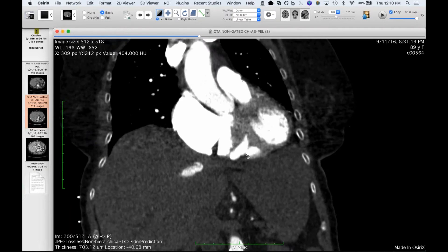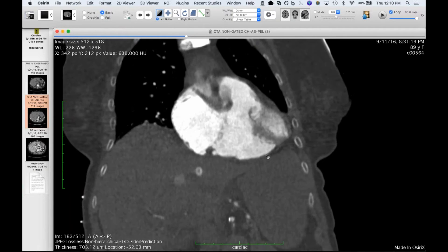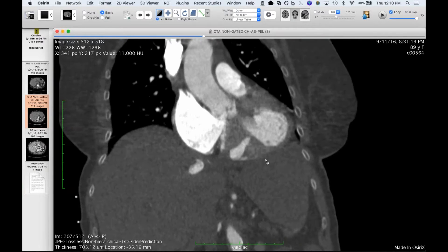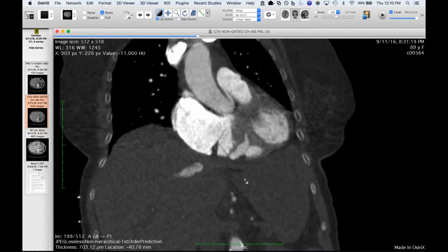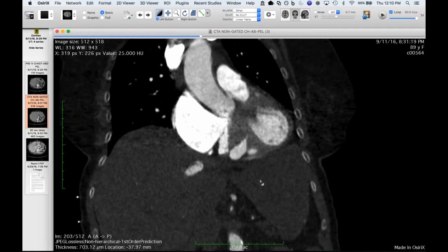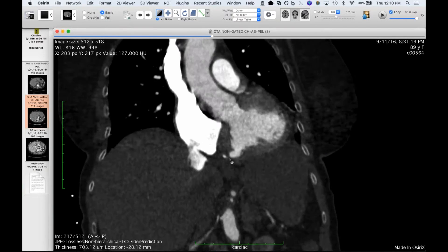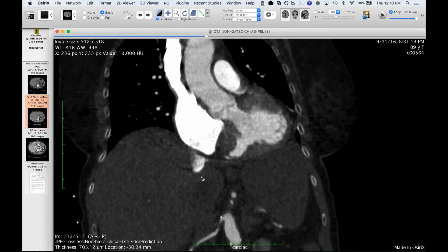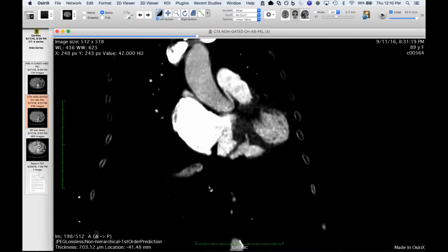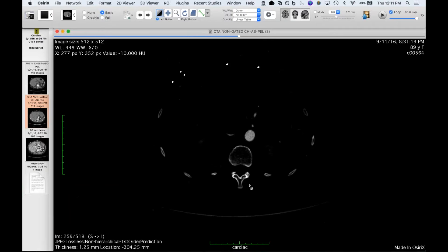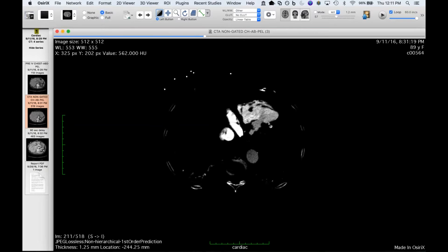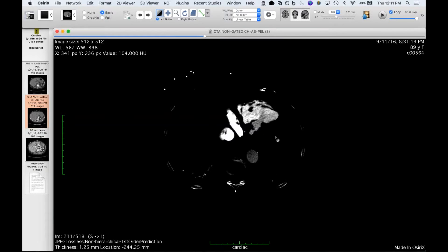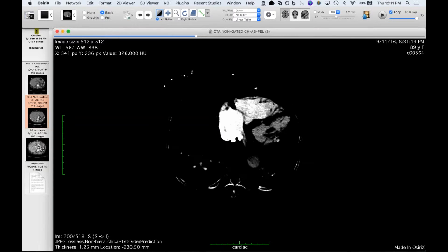She again elected not to have anything done and passed away a couple hours after this study. Notice how close this is to the pericardium — I wonder if she ruptured not only into the RV causing this acquired VSD, but also ruptured into the pericardial space, resulting in tamponade and acute demise. I think Catherine Olson showed one of those combined VSD ruptures plus pericardial space rupture from MI. Even if you overlook the VSD at first, the fact that her RV and right atrium are dilated — always look for a shunt. On the axial, you can see the subtle contrast difference, a little contrast jet squirting from left to right with slightly less opacified contrast. Kudos to your resident — great observation.